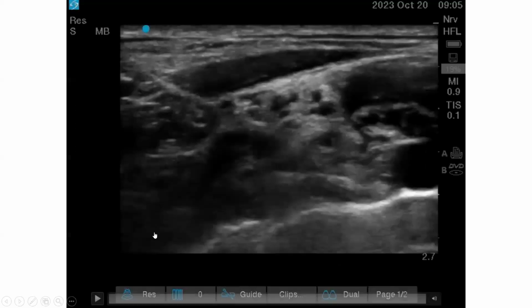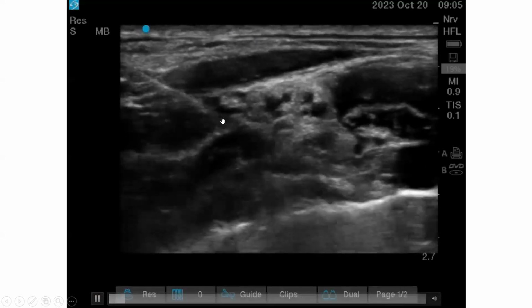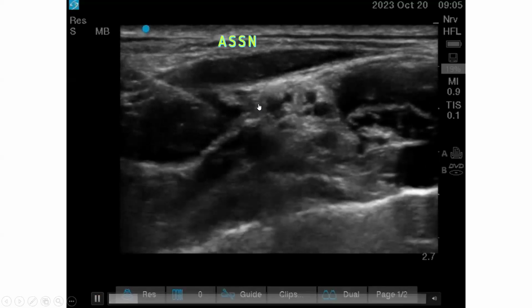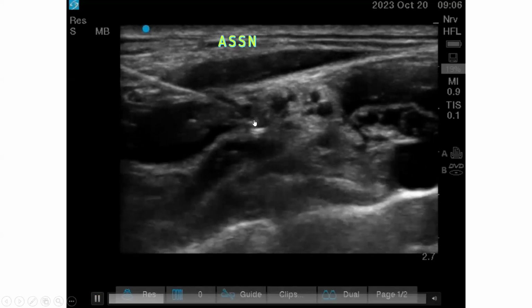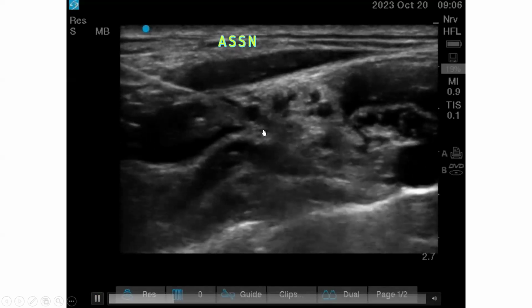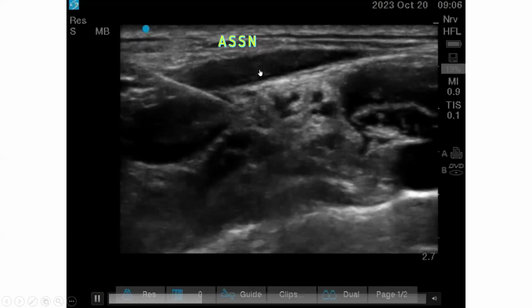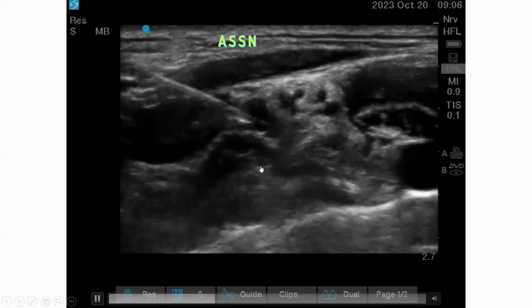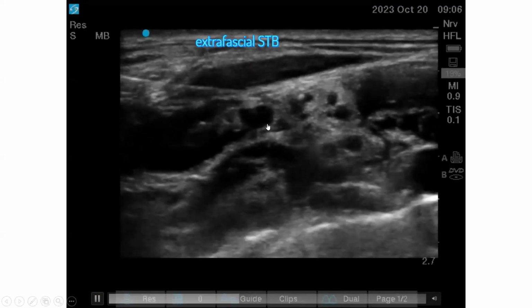The second is about the isolated suprascapular nerve, where you start injecting local anesthetic lateral to the suprascapular nerve. So this is the isolated suprascapular nerve block, and you can inject around 1 to 4 ml of local anesthetic. So this is the omohyoid muscle. So that's the local anesthetic spread. It is just around 1 to 2 ml.